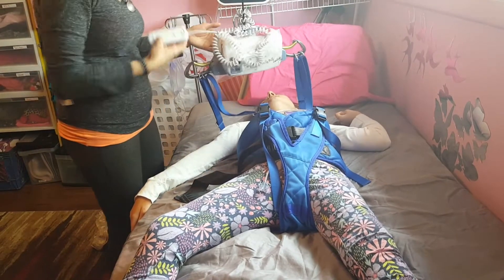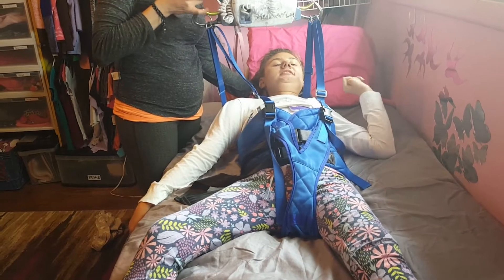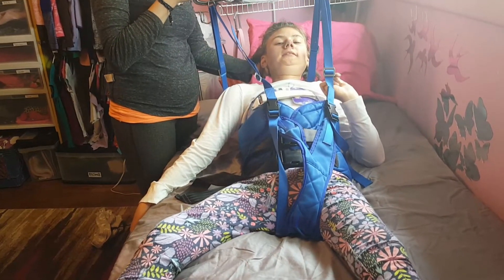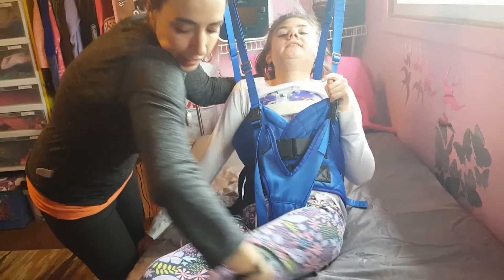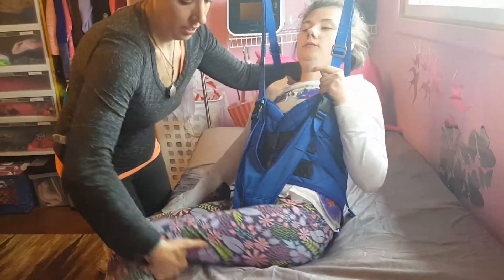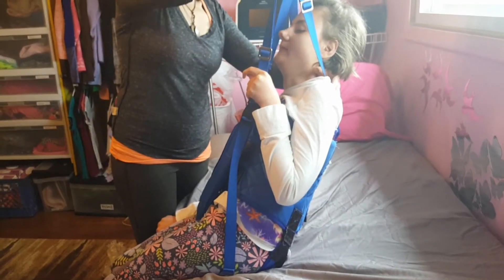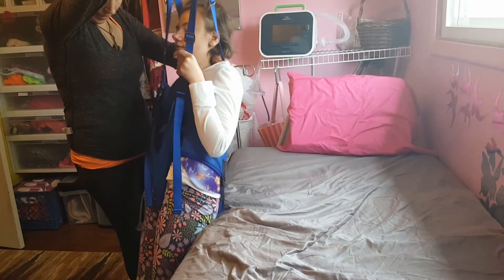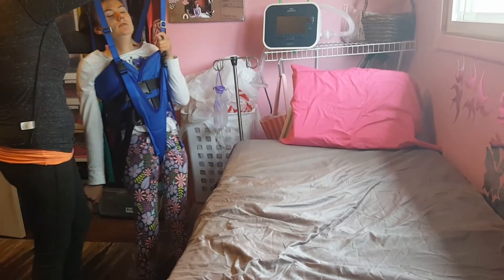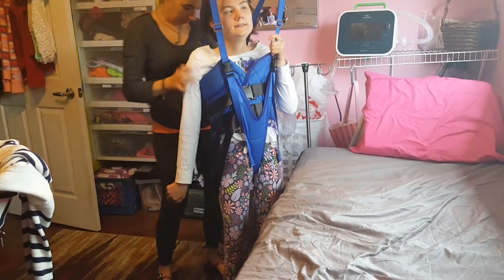Now we're going to go ahead and lift her up. I just kind of hold on to the back of her head during this process so it doesn't hang back there. And then once she gets up to a seated position, you're going to want to go ahead and pull her legs on over to the side and get prepared for her to kind of hop off. So we'll take her a little bit higher. And then kind of just shove her on off, or she hops off. And that's how we get into our walking harness.